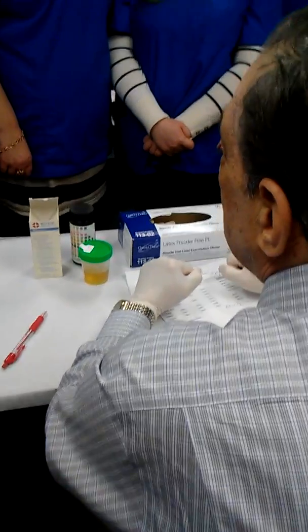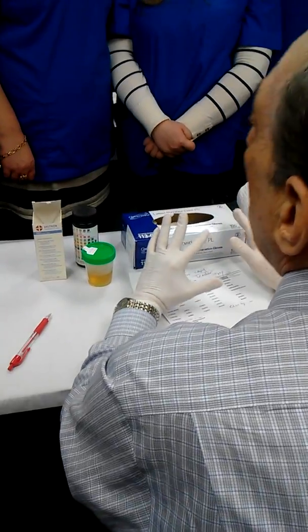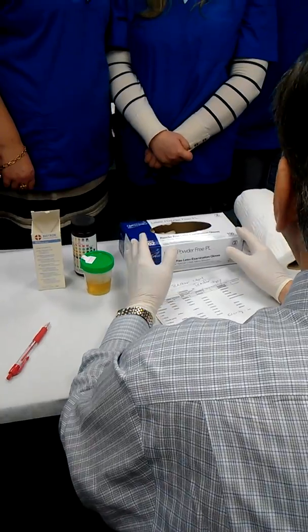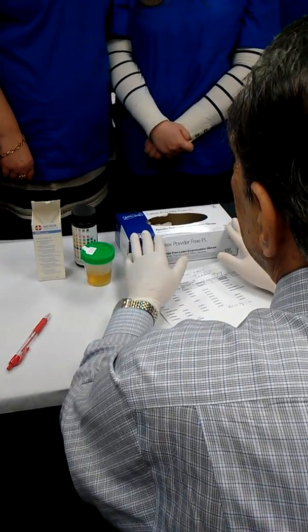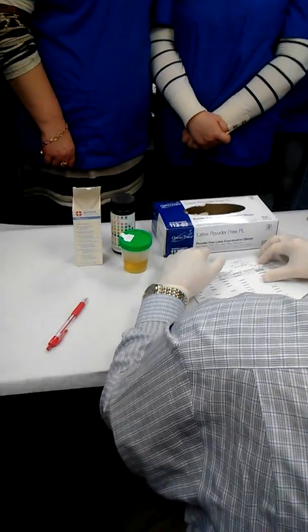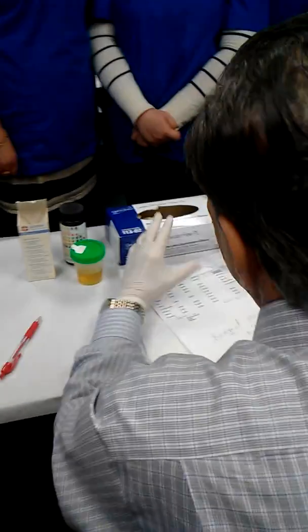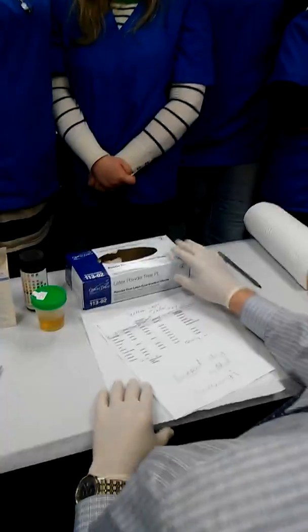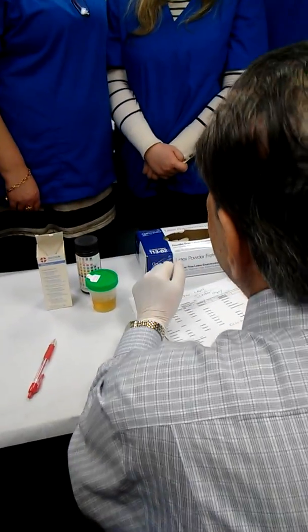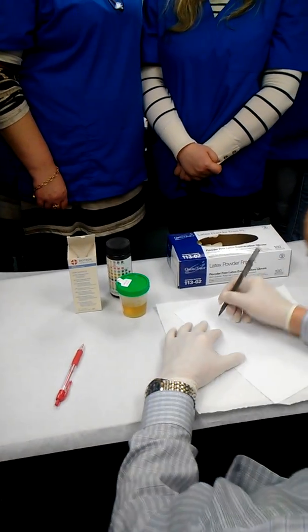People come, for example, complaining of frequent urination, pain on urination, or burning sensation on urination, right? So this is a sign of urinary tract infection, infection of the urinary tract. In this case, we have to do this test. It's a screening test. Screening means quick test, right? Not a complete test. Besides, we have quantitative test and qualitative test. This is a qualitative test.